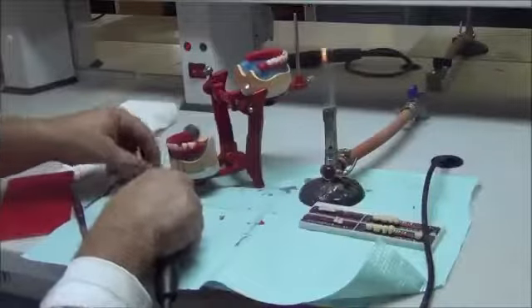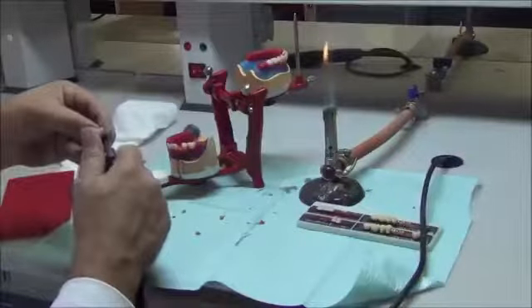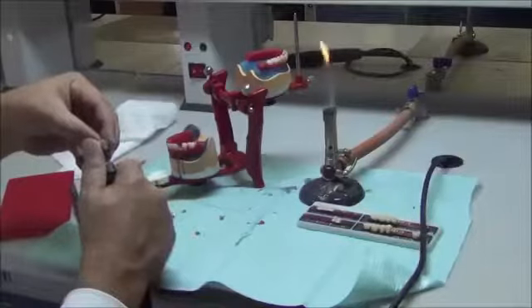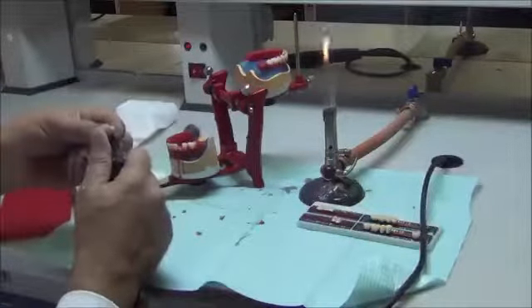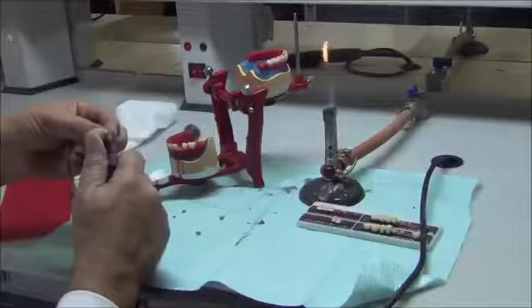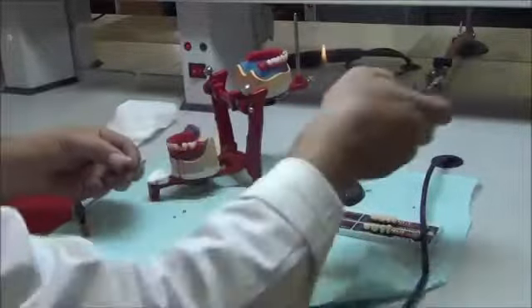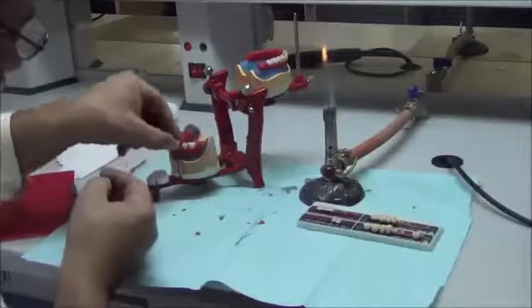Remember that when you remove, the surface will be very straight, so make a roundation. So go slightly to the labial and slightly to the lingual to reduce the straight shapes and return the tooth with curves. So it's not a straight cut onto the tooth surface. So go back and make it round. And then we try to fit it in place.